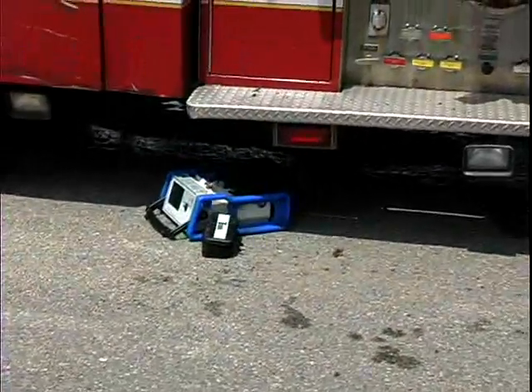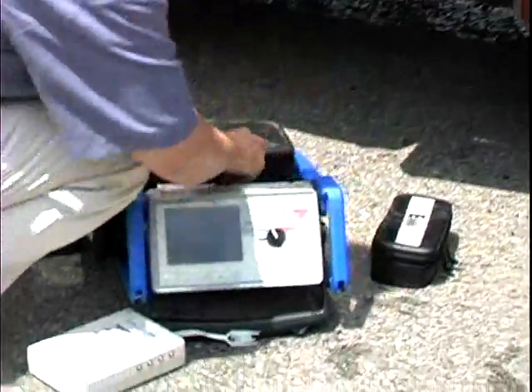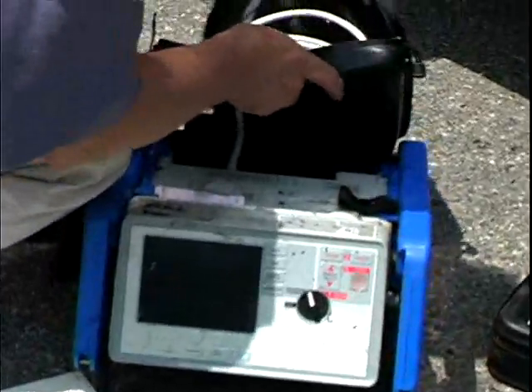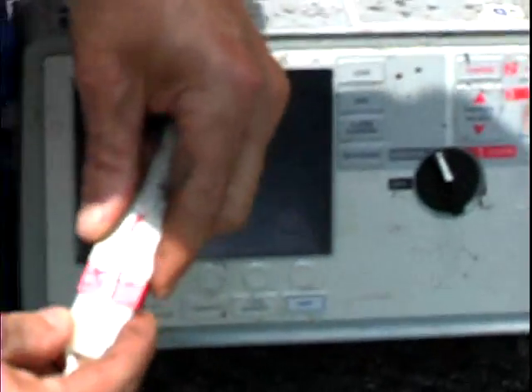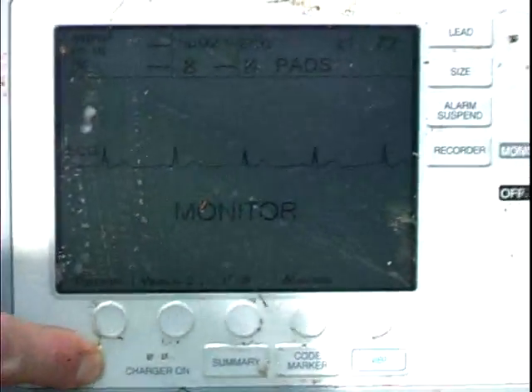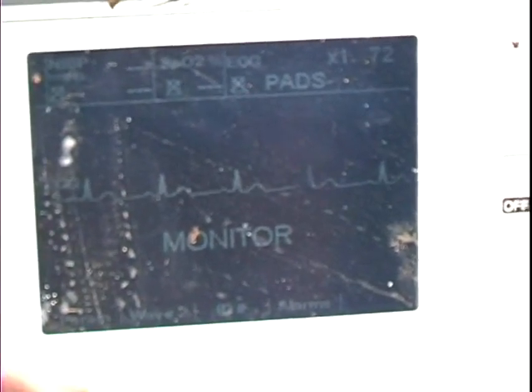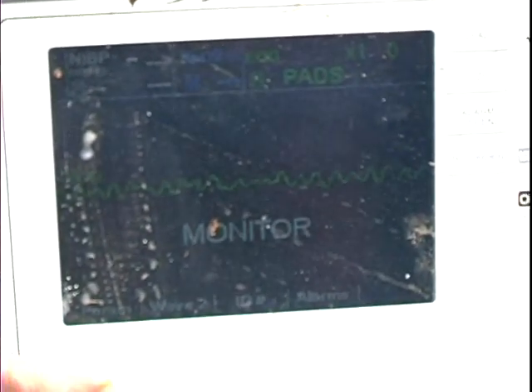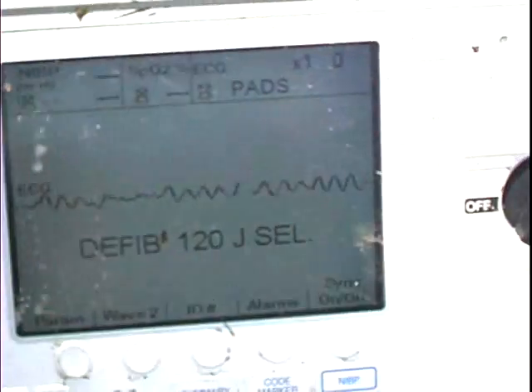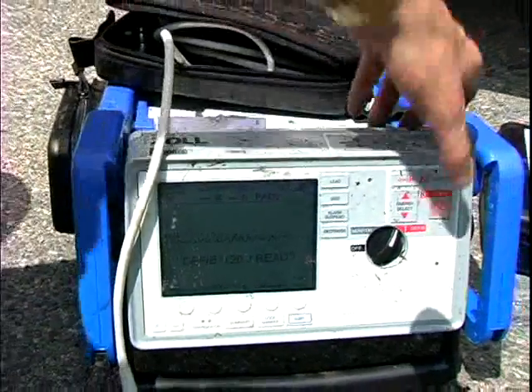Here we are simulating a drop off the top of a fire truck. As you can see, the side pocket came off — no big deal. The device is starting to get a little bit beat up, but once again we hooked it to a simulator, turned it on, adjusted the display for optimum viewing, decided to see what would happen when we charged it up, and sure enough we were able to deliver a shock back into the simulator, and you'll see that on the display.